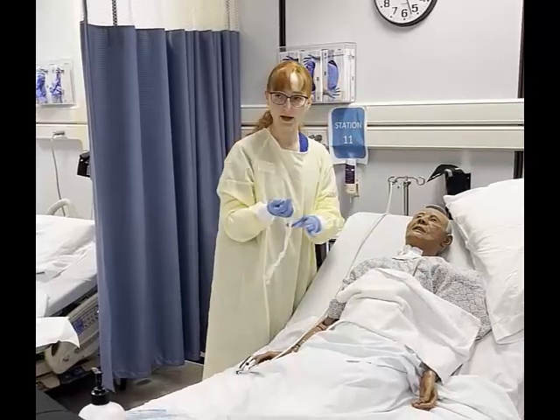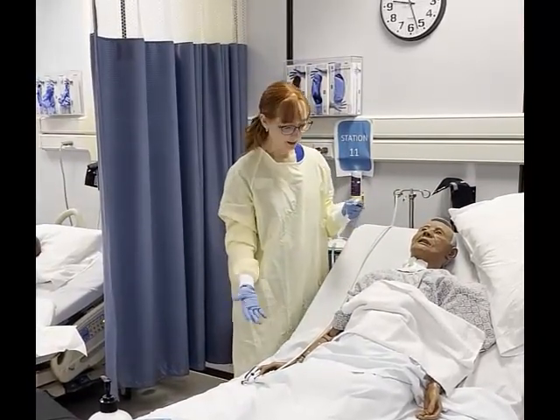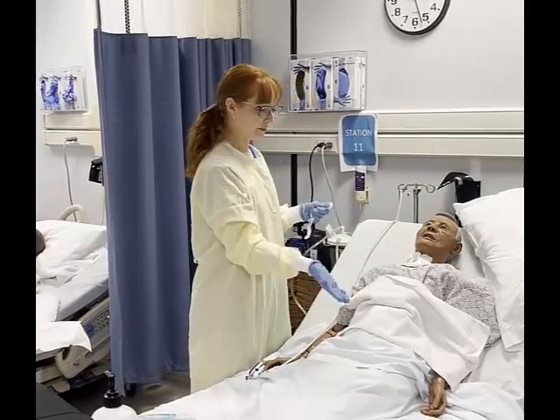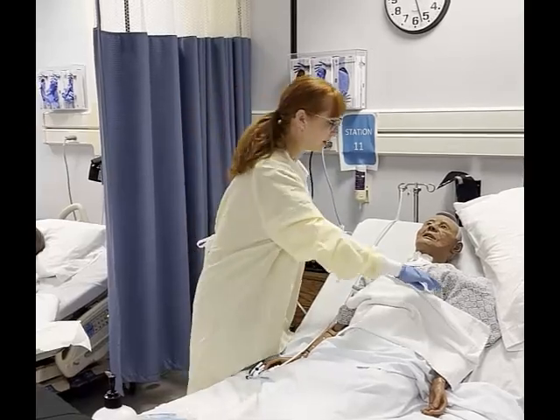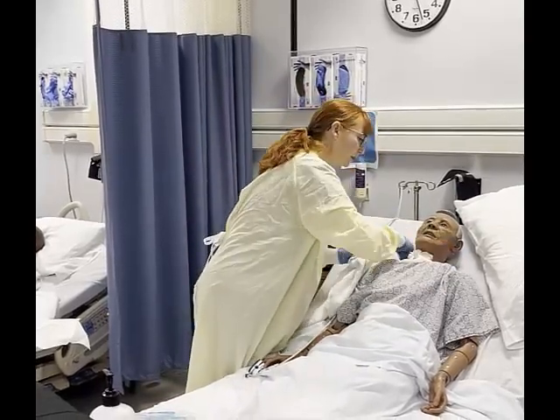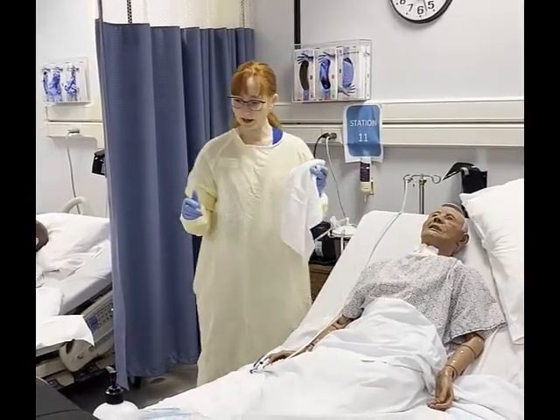Everything looks good. The patient tolerated it well. I can check his oxygen levels. Bill, how are you feeling? Maybe he's giving me a thumbs up. I'll retie the back of the gown, put the pillow back, lower the bed, and raise the rails.